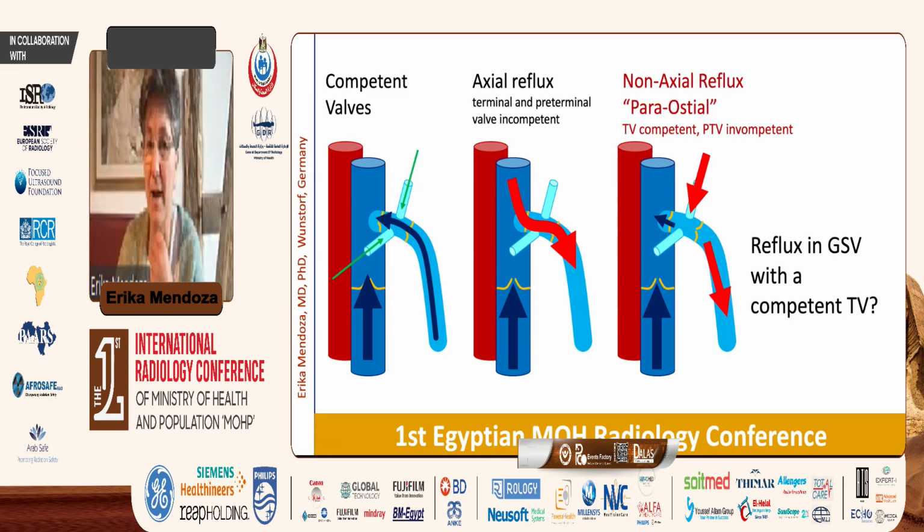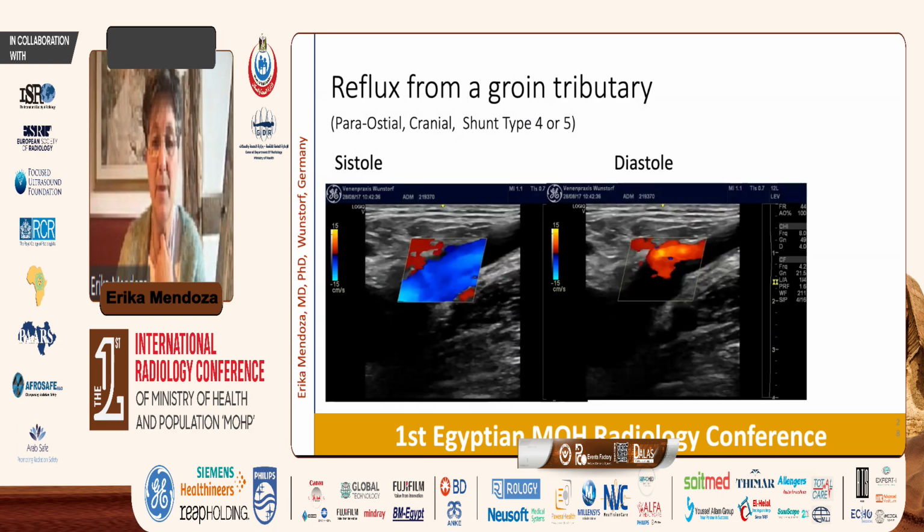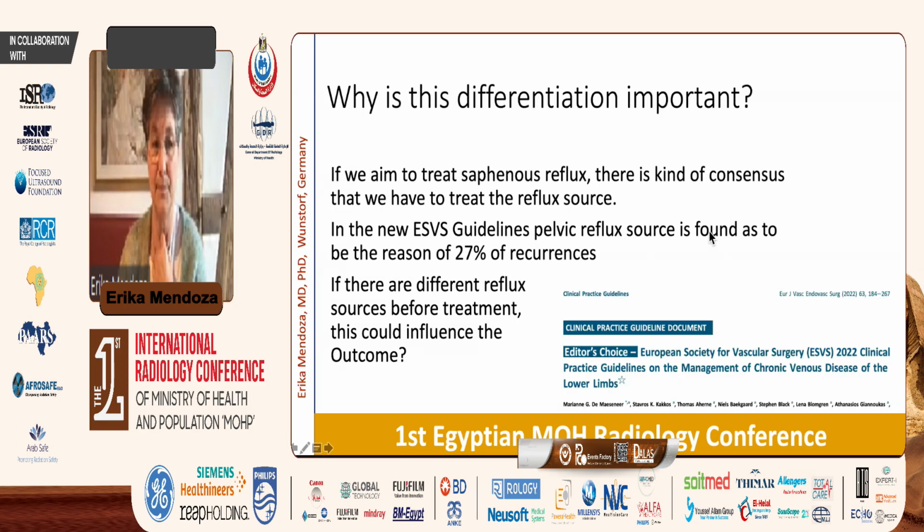This is so-called paraostial or non-axial reflux, which is a competent terminal valve, incompetent preterminal valve. And in the ultrasound image, it is completely different. You see in the systole, the flow goes in from the superficial to the deep vein. And in the diastole, there is no exiting here. It is a reflux from the tributary of the groin inside the great saphenous vein.